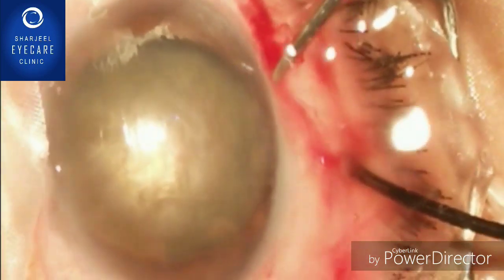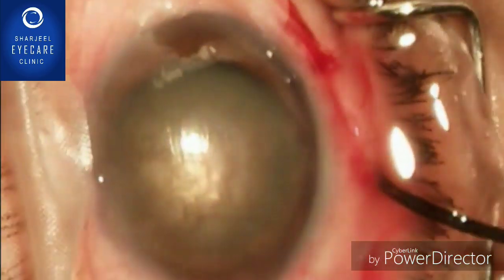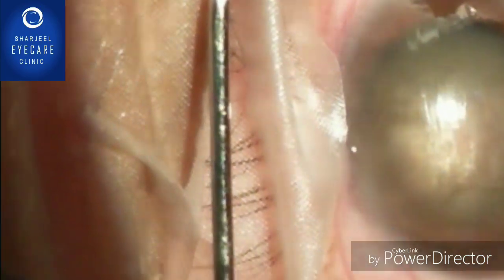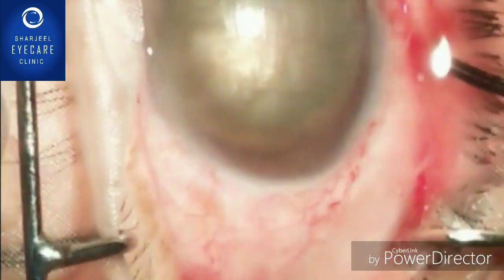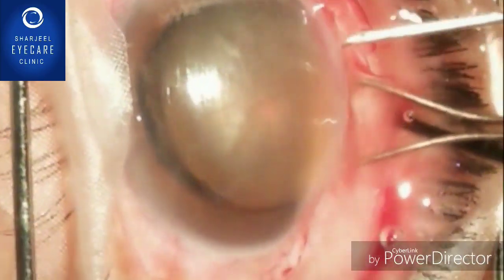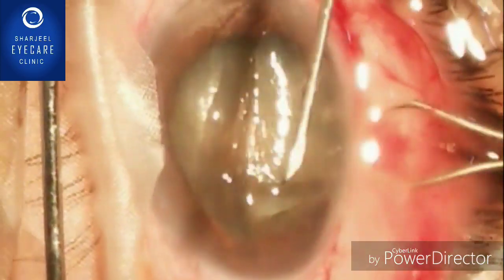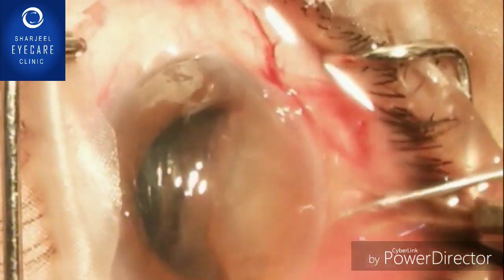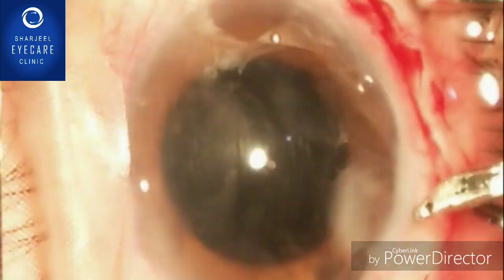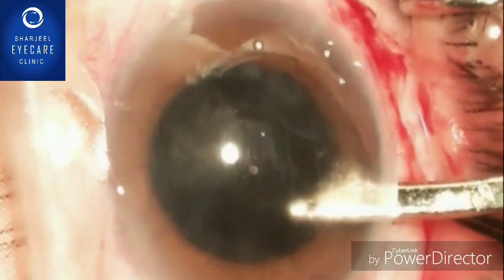This is a very critical step in the management of a subluxated lens. The nucleus is almost at the edge of the main wound, but the wound was smaller so we are enlarging the wound in order to preserve the remaining zonules. We are exerting positive pressure with the wire vectis, slowly and gradually trying to deliver the nucleus. Our main aim is to preserve the bag — and we are successful. The bag is present, but superiorly the zonules are broken.